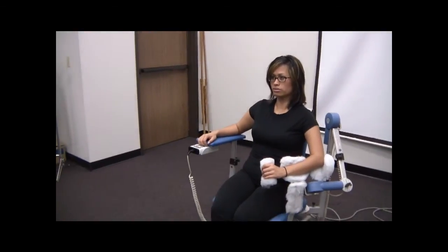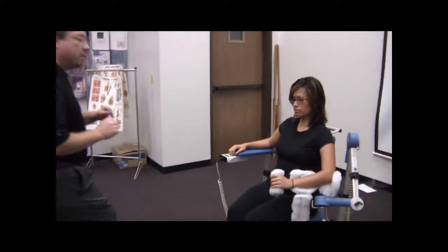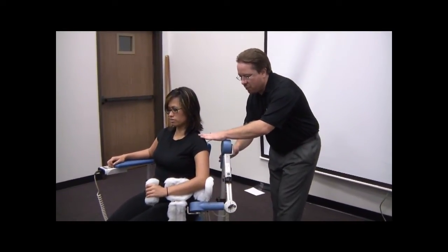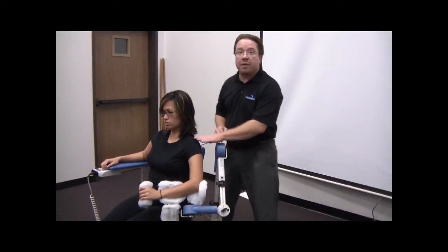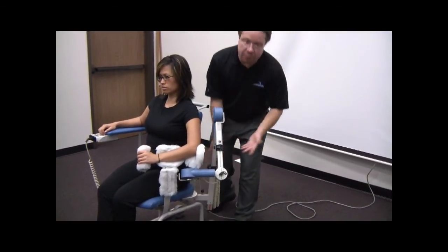Okay, don't want to droop you on one side or lift you. I want to keep you comfortable and even shouldered there. Feel okay there? Okay. So the patient feels okay. If I go off the top of my motor, I'm going to line up with the top of her shoulder, and my pivot points are going to line right up as well. So I'm happy with this, and for her, this just happens to be 30.